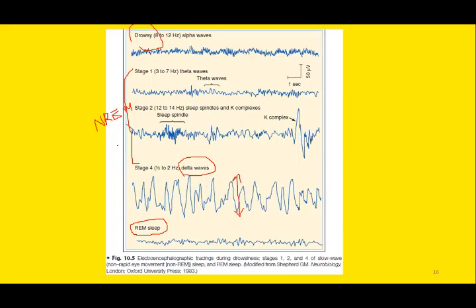And these are the sleep spindles. Here you can see sleep spindles are bursts of electrical activity. Here you can see a high frequency burst of electrical activity followed by a large wave.